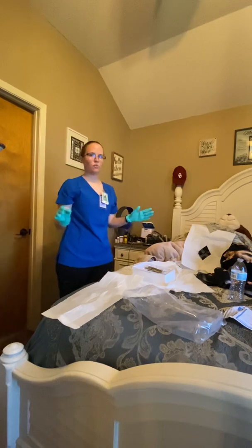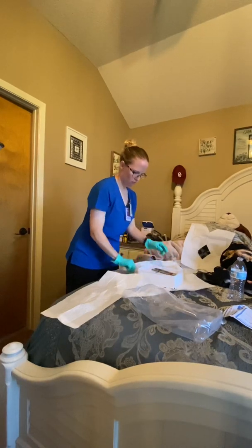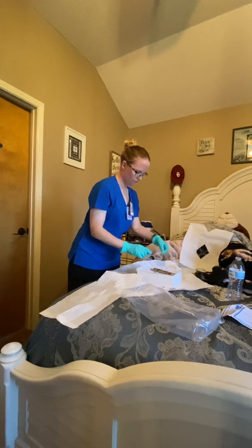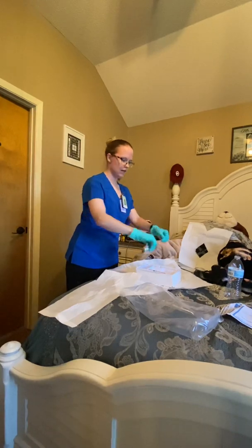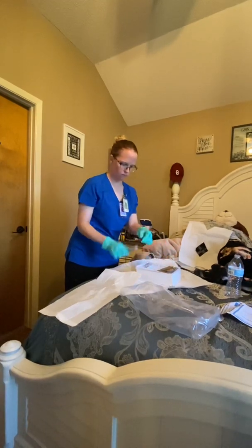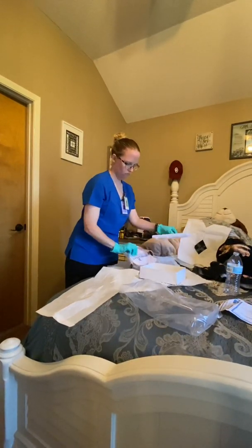Next, we're going to arrange all of our supplies. Our lubricant. We're going to open this and we're going to place them on the kit. Have our swab sticks. We will open these. We'll place them on the kit as well. We have our syringe. And here's our catheter in the bag.